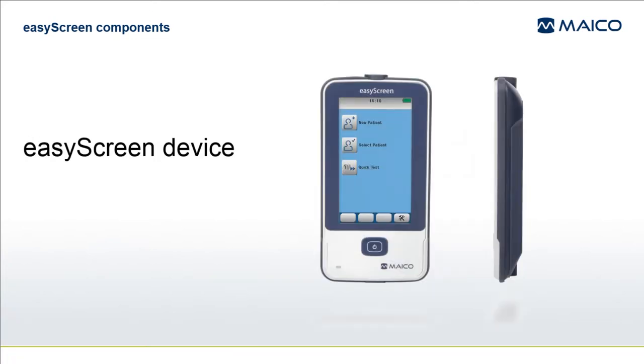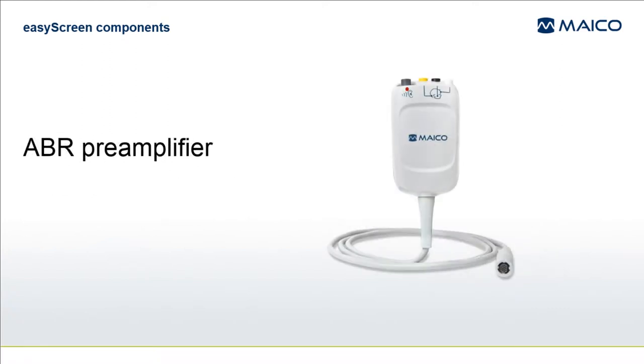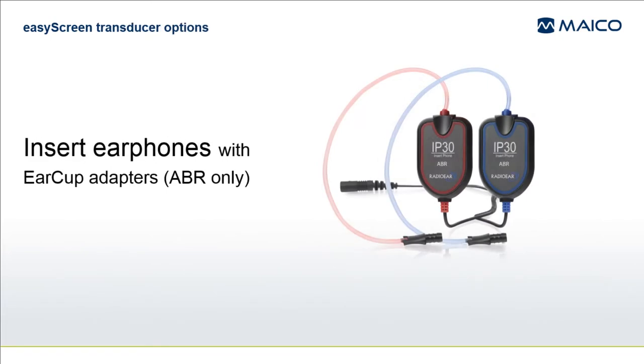Inside the case you will find the EasyScreen device, the charging cradle and its power supply with a variety of plug adapters, the ABR pre-amplifier. You will also find the acoustic transducer that was included in the system configuration you chose at the time of purchase.